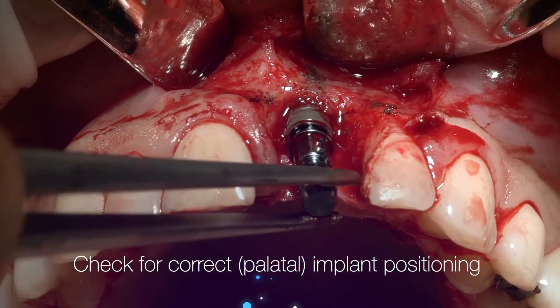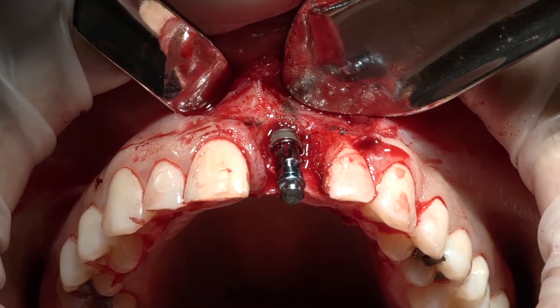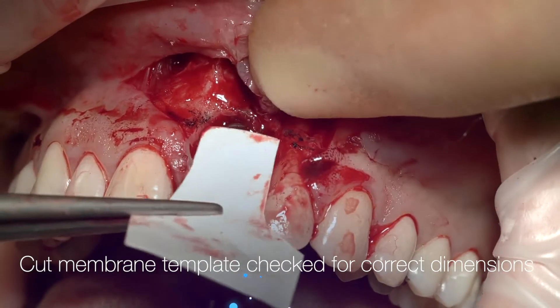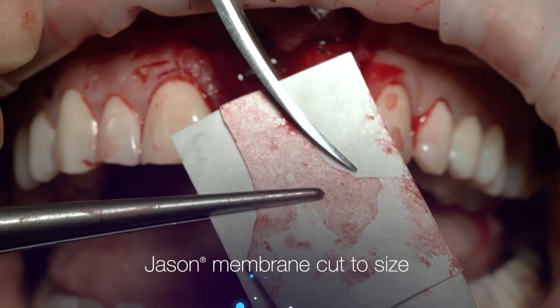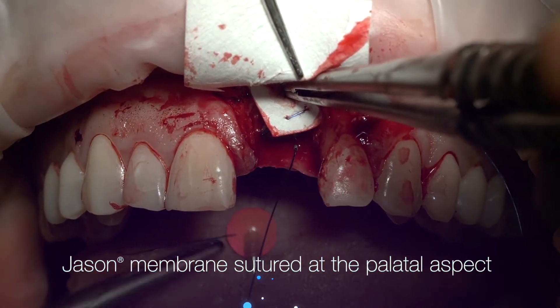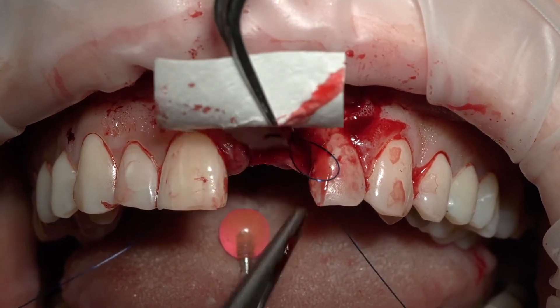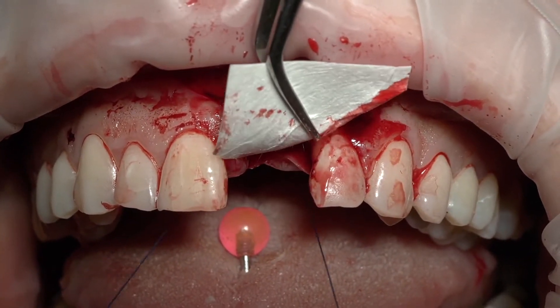With a two-millimeter healing abutment you can see the position of the implant — palatal. Another trick: just put a line here and you can see the adjustment. When you want to do your GBR, number one rule — do not fold the membrane like that. As you do that, you cut the membrane accordingly, pull it out, and as you tie that suture the membrane is going to be supported inside the tunnel.